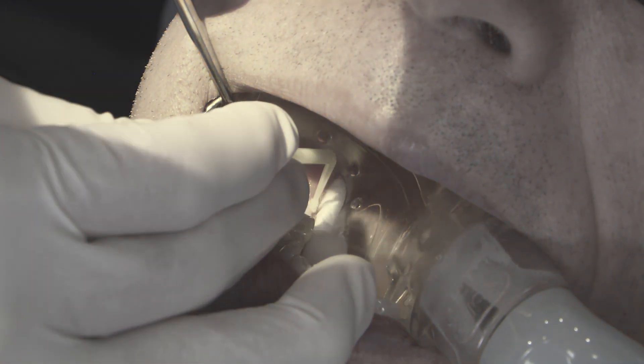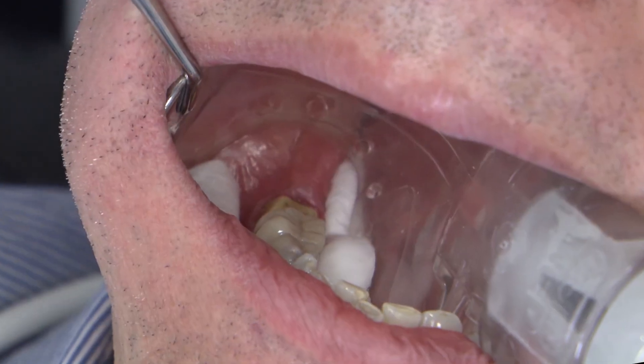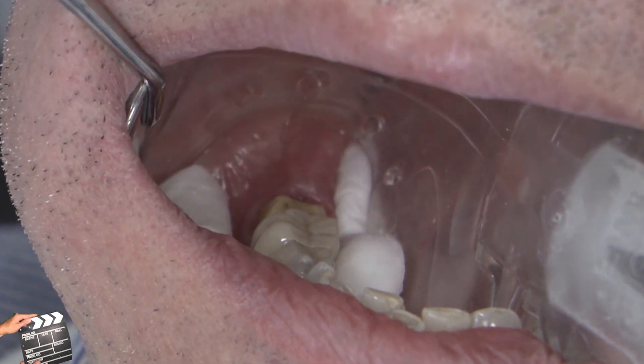That just helps, for me, minimize the risk of contamination. So starting off on the occlusal, working your way down, and finishing off along the margins — but making sure you scrub that in really well.